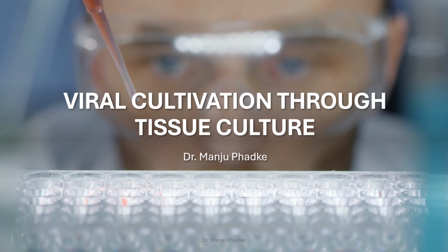Today we are going to be discussing the use of tissue culture for cultivation of viruses. Tissue culture is a laboratory technique where the cells or tissues are grown in a controlled environment outside of their natural biological context. It was first demonstrated by Enders, Weller and Robbins in 1949.